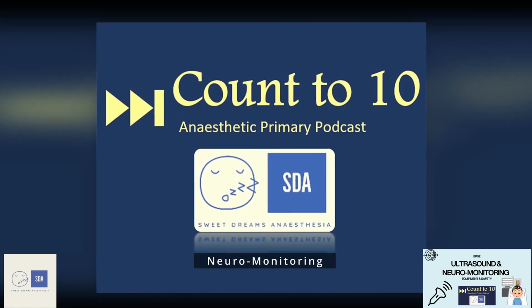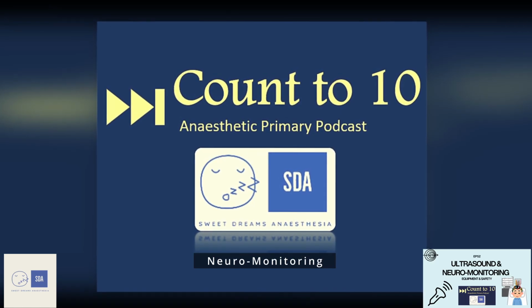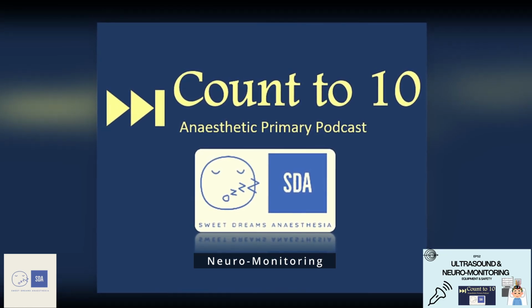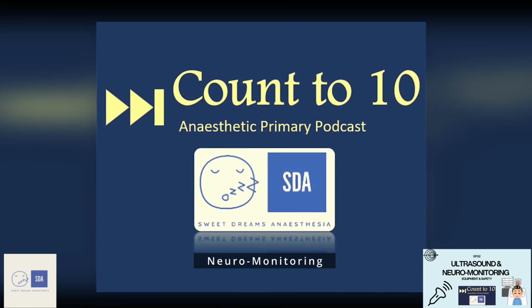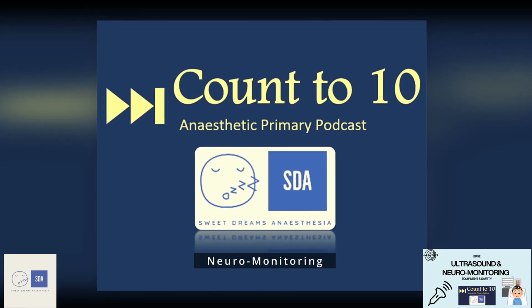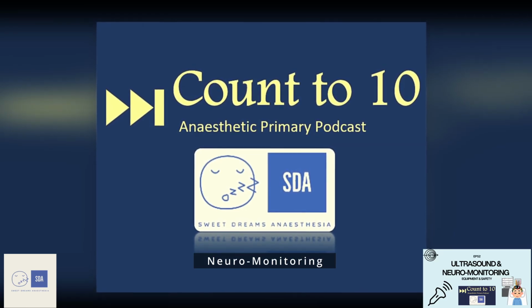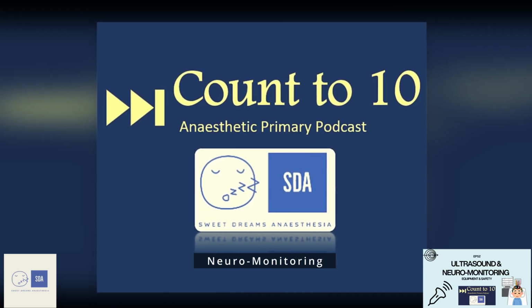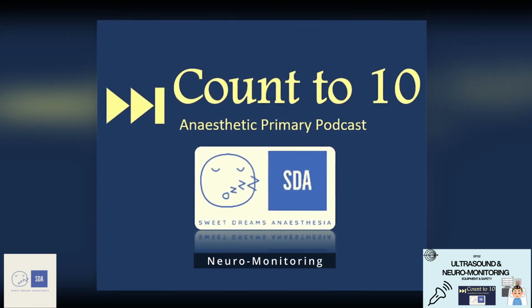You have the middle section which displays its own version of a dimensionless index referred to as a patient state index, also going from 0 to 100, where instead of with BIS, the optimal anesthetic range being between 40 to 60, with the patient state index, or the PSI, the optimum number is between 25 to 50 for adequate depth of anesthesia.